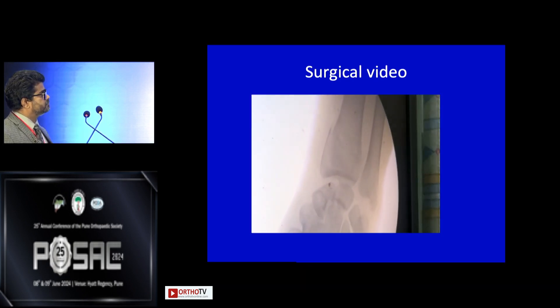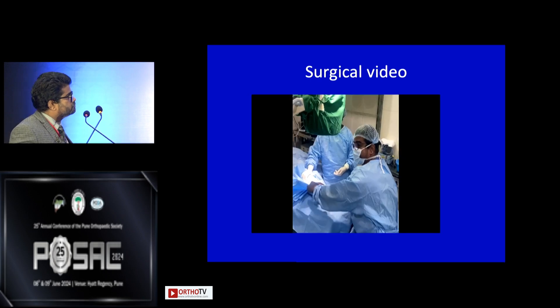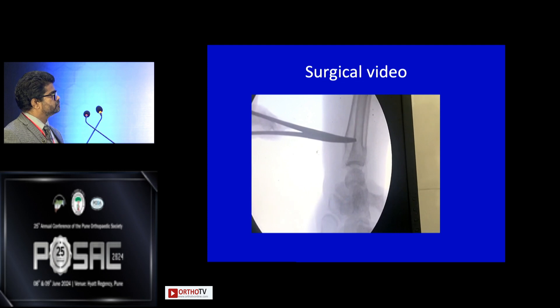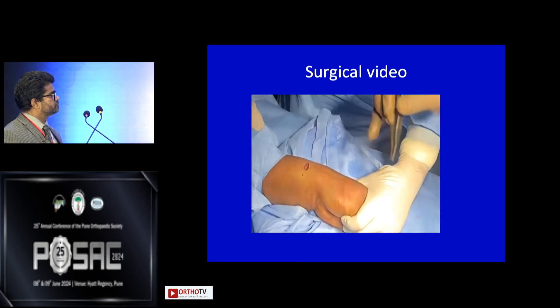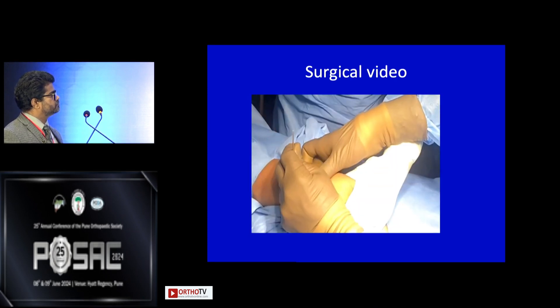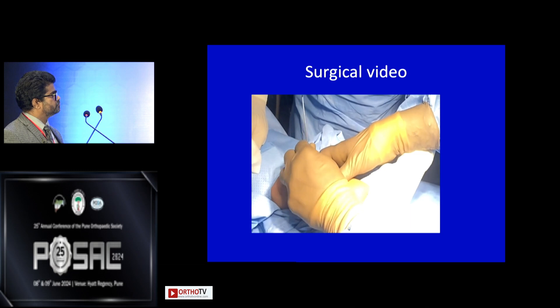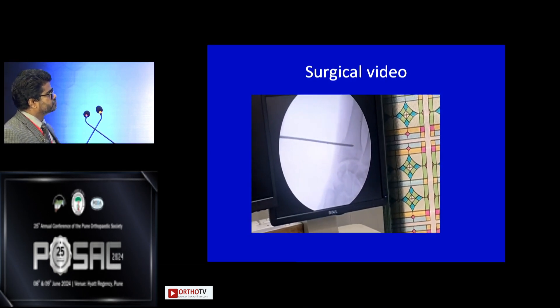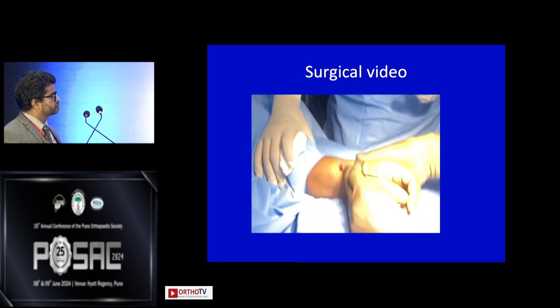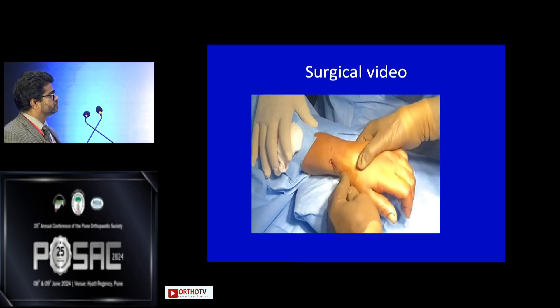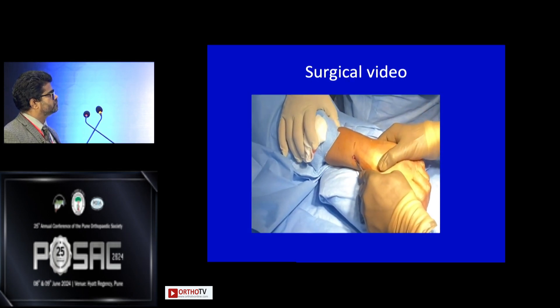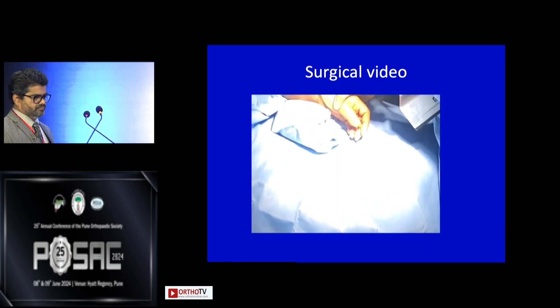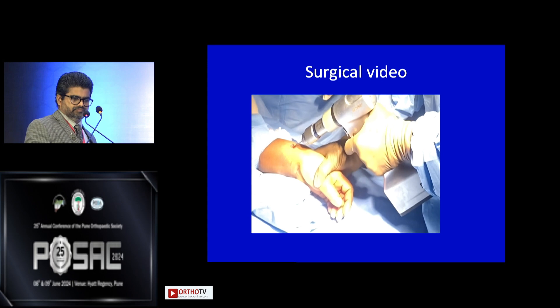We first screen the fracture under C-arm in AP view to see the fracture site, and then in lateral view. The first incision is made radially at the fracture site. We look at the fracture and pass the K-wire horizontally from the fracture site, then bend it to a 45-degree angle to reduce the radial tilt of the fracture. We then screen under the C-arm and drill the near cortex and far cortex, confirmed under C-arm.